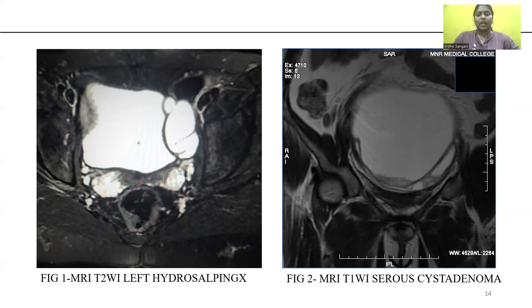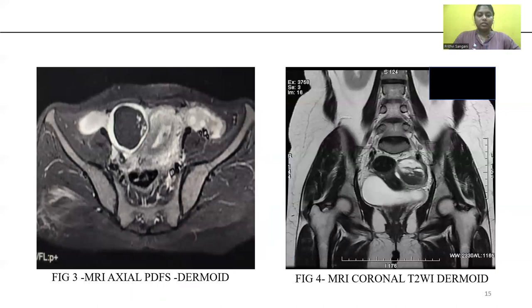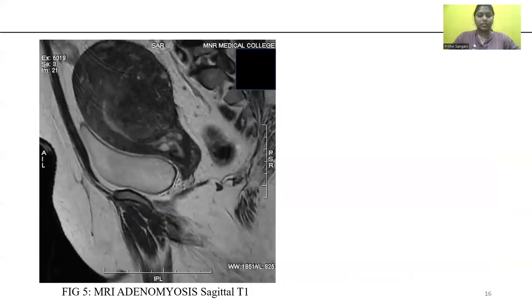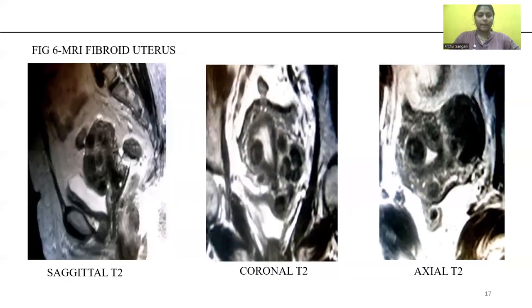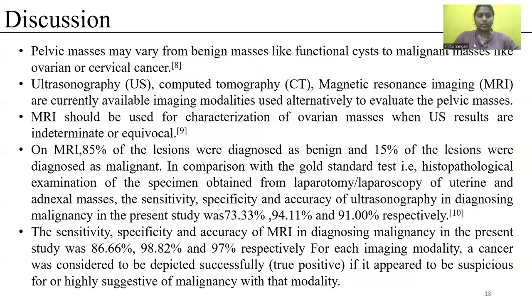Images shown include: a T2 coronal image of left hydrosalpinx and a serous cystadenoma. Images of a dermoid case are also presented. A case of adenomyosis is shown. A case of fibroid is demonstrated in sagittal, coronal, and axial planes.